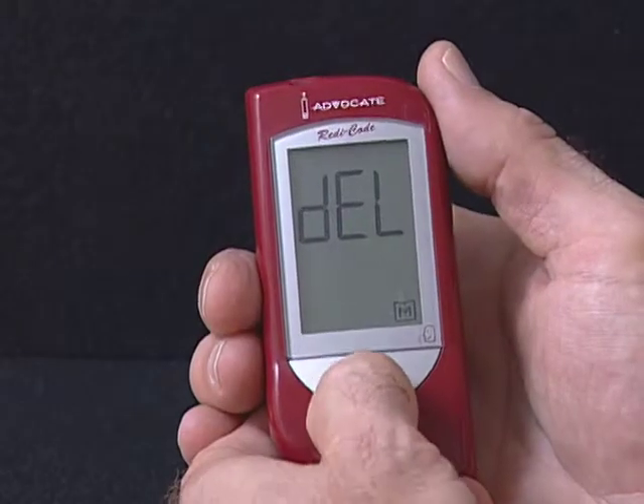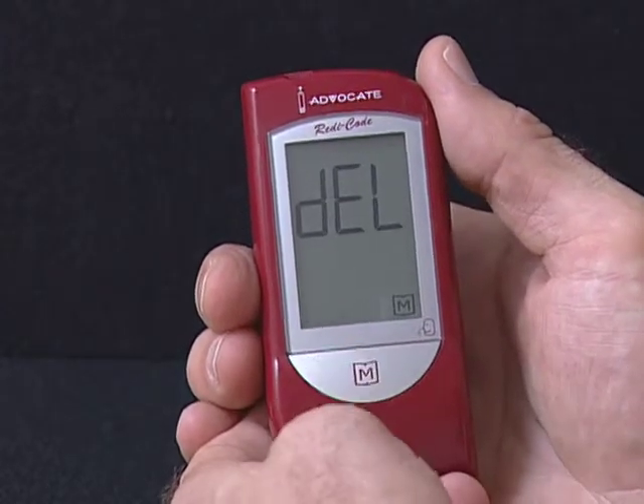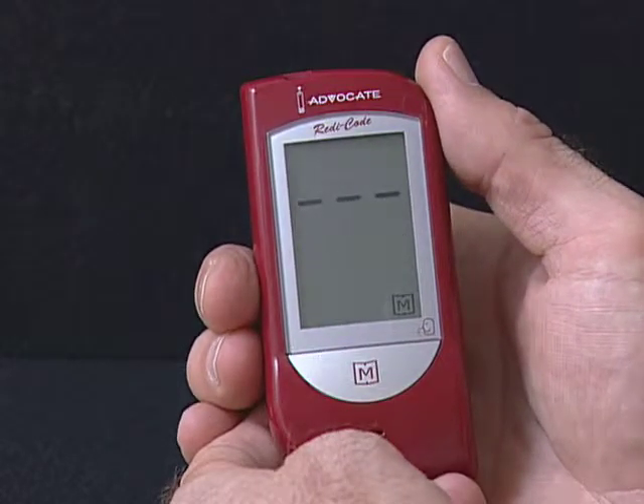If you would like to delete all memory, press the M button. Both DEL and the M symbol will flash. Press the M button again to delete all memory. Three dashed lines and the M symbol are displayed on the meter.